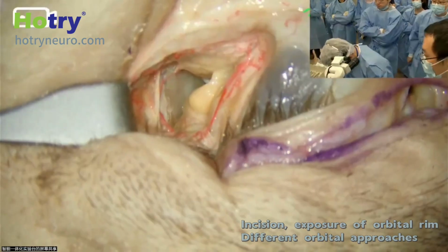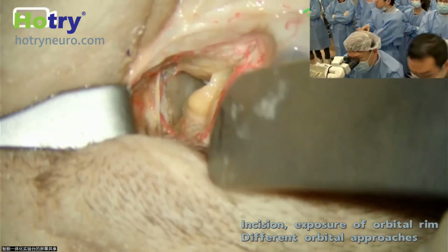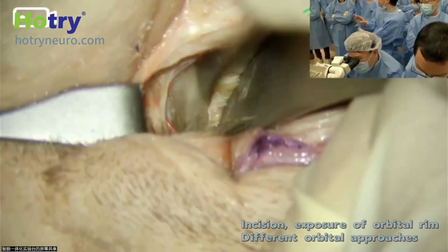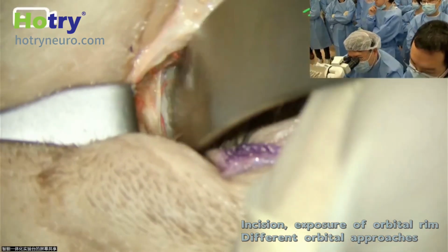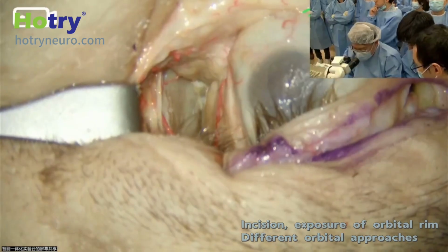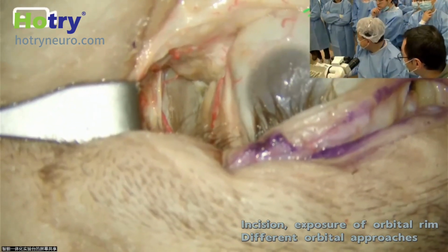So for all these approaches demonstrated, at the beginning we don't need to use the endoscope. At the first part, no. But after we make the incision, when we go deep inside, I think using the endoscope is nice.